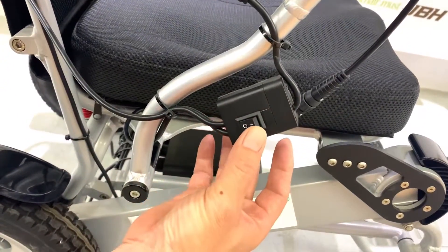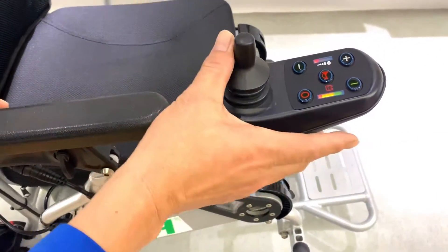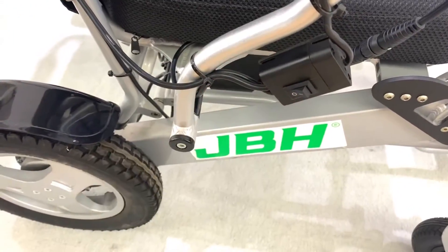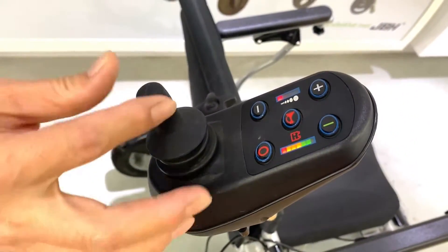We can touch the switch here, which allows us to have caregiver control from the back.